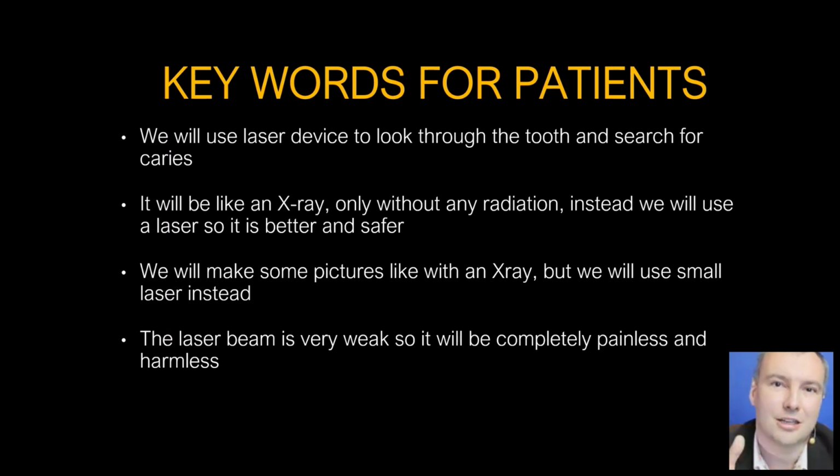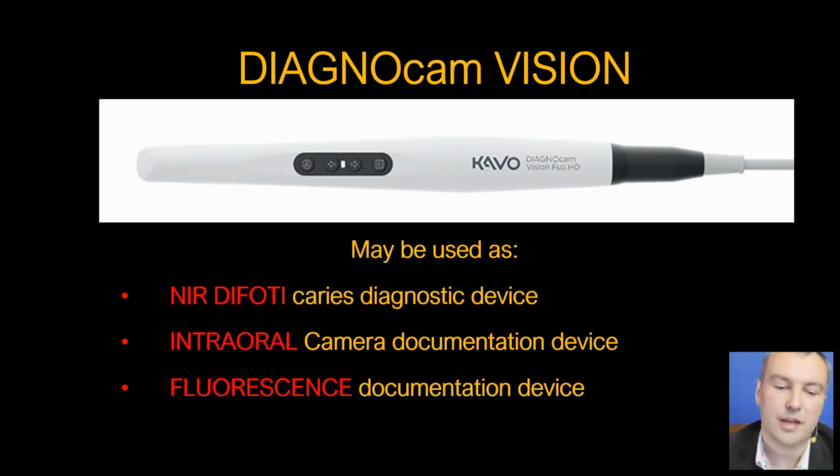Also, when I say it's like an X-ray, it means that I will probably expect my patient to pay for such an examination, as it is normal that we pay for X-rays. We will make some pictures like with an X-ray, but we will use a small laser instead. And for those who are very nervous, the laser beam is very weak. It will be completely painless and harmless. You know, laser is also connected with some sci-fi movies where usually it is a very destructive device. So we need to say that it's very weak. It's harmless for everybody.